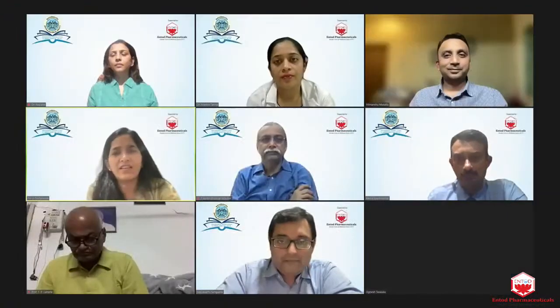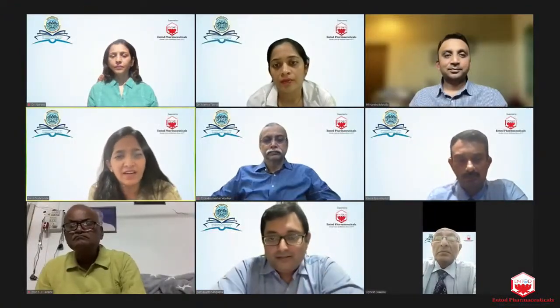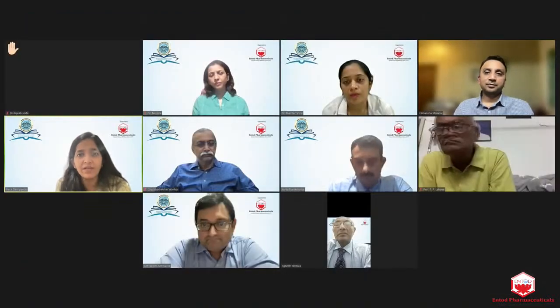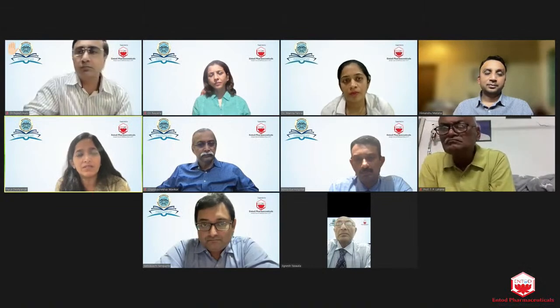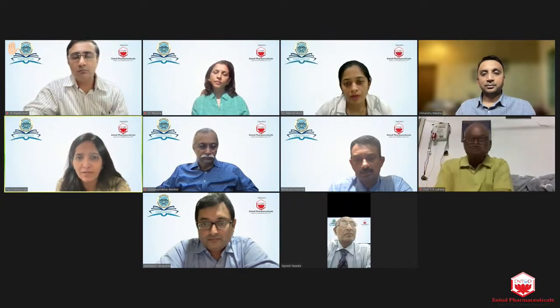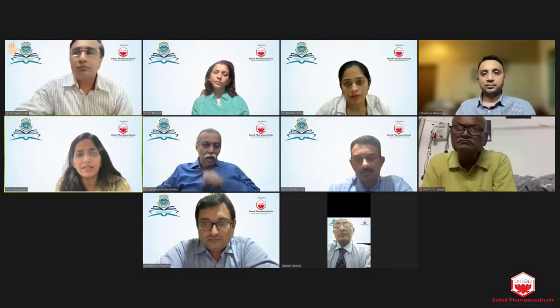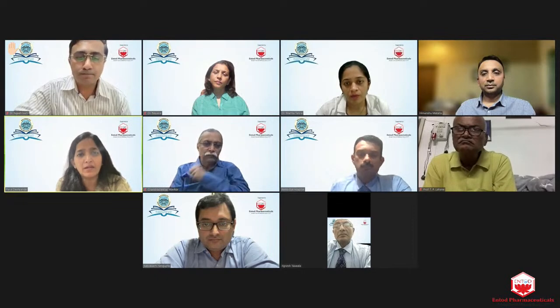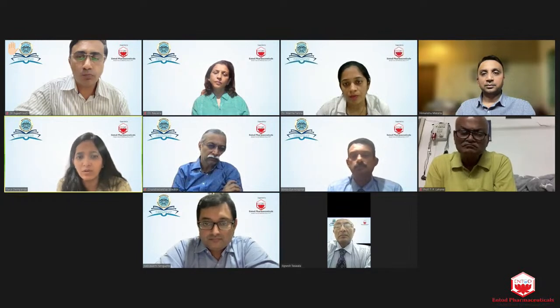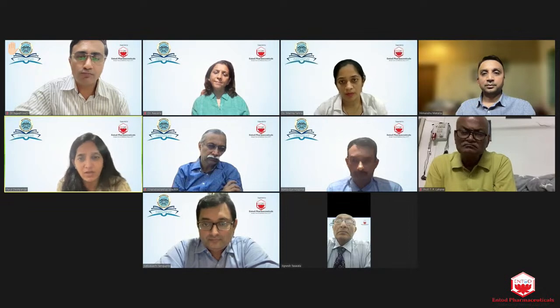Yeah. I just want to make one comment that Savini et al. is the article we should talk about. If you see the table that they have given, in the milder cases, the grade 1 cases, they have shown that most of them have equivalent results, except that SRK/T had slightly better performance. Otherwise, for most of the formulae, the IOL calculation was fairly good in the mild cases. In severe cases, I think it was bonkers for all.